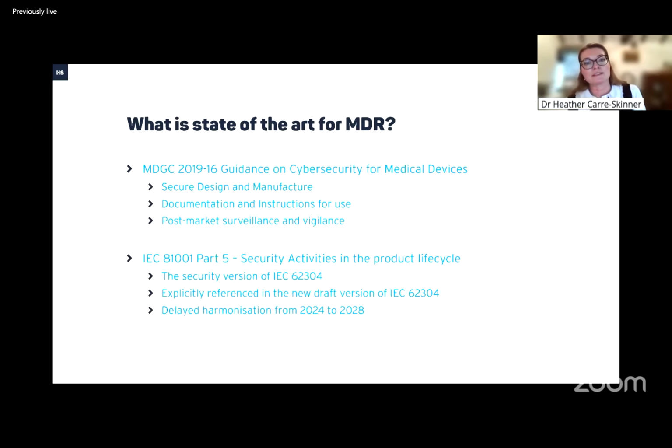So let's have a look a bit more into that. What is state of the art for MDR in terms of cybersecurity? We have the MDCG guidance, cybersecurity for medical devices. This looks at secure design and manufacture, what you need to include in documentation and the IFU, as well as guidance on post-market surveillance and vigilance.